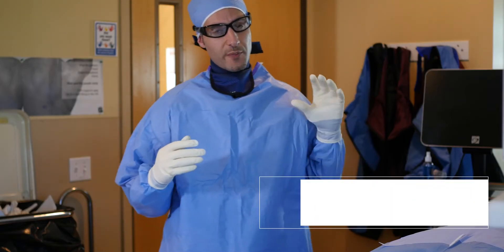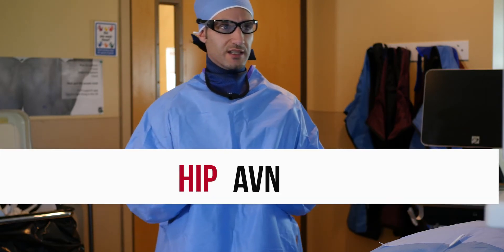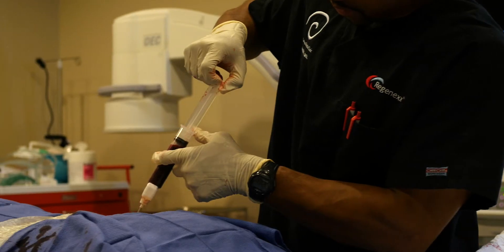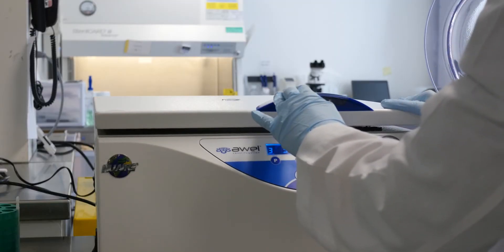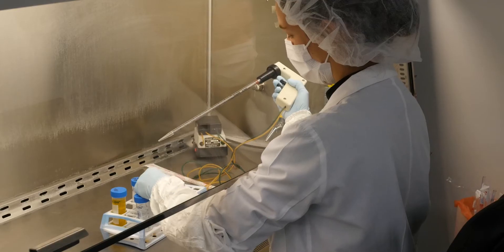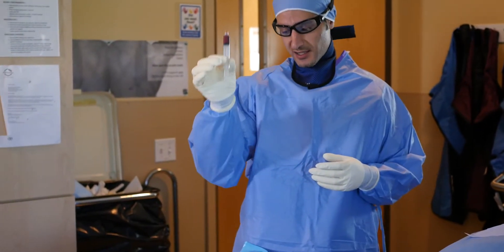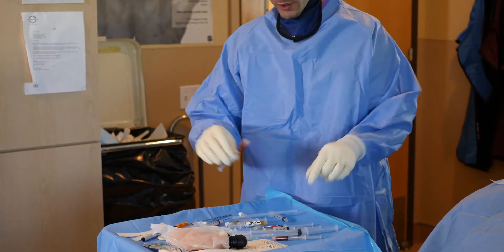Let's take a look at what advanced interventional orthopedics looks like for an avascular necrosis or AVN patient. We have a patient today; we're treating an ARCO grade 2 avascular necrosis in his left hip. This morning we did an ultrasound guided bone marrow aspiration. The bone marrow was then centrifuged down — the progenitor cells, mesenchymal cells, adult stem cells are part of those cells. We have about 5 cc's of cellular material mixed with some blood products for different targets.